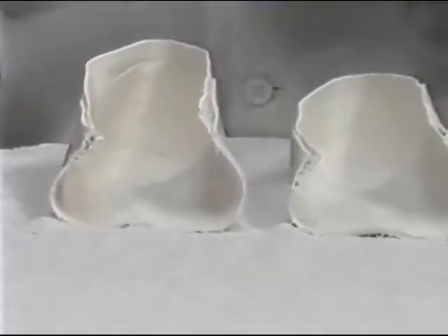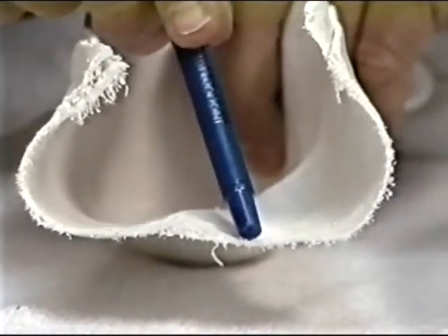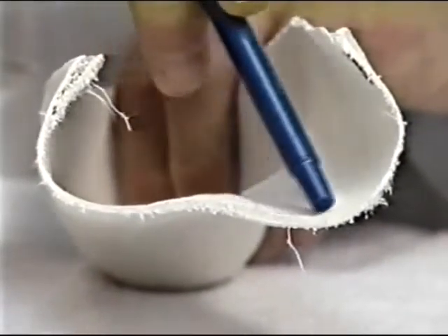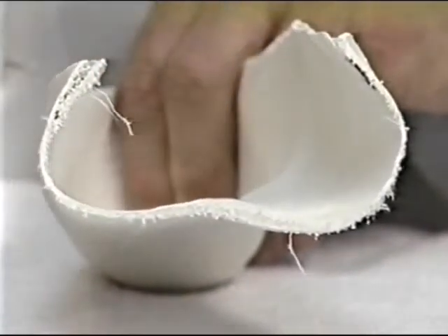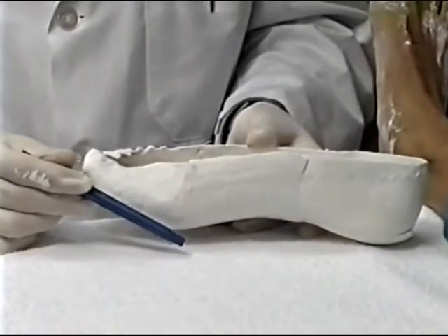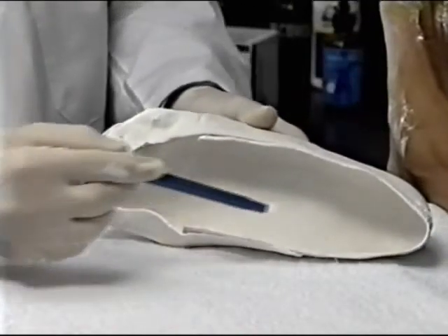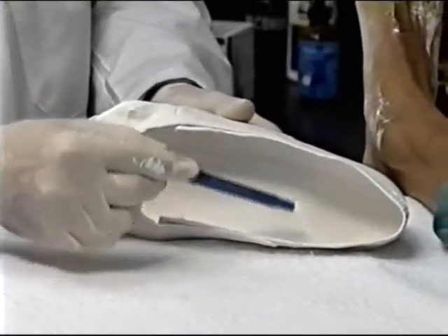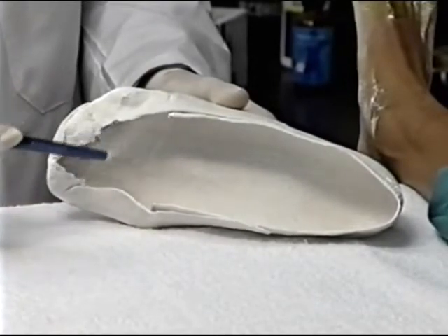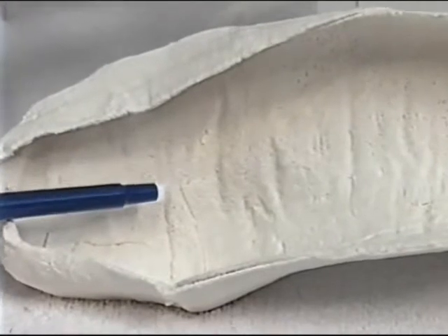Four, the first metatarsal impression should not be flat, as shown here on this cutaway cast, but concave from anterior to posterior as well as from medial to lateral. Also, the hallux should be slightly dorsiflexed. Five, skin lines should be observed throughout the cast, demonstrating that no air bubbles have occurred. When wrinkles occur, as shown here, an inaccurate impression of the foot has been made.